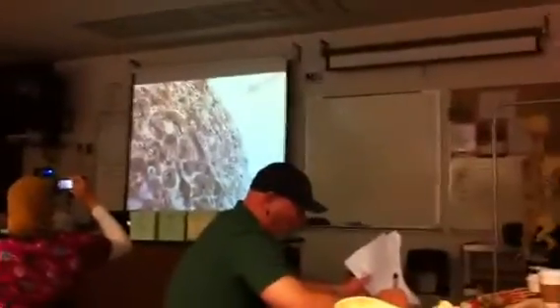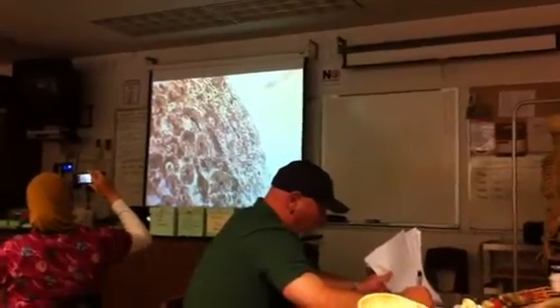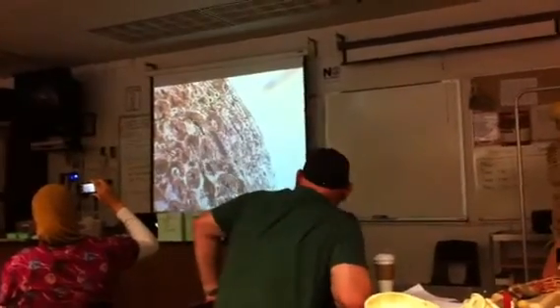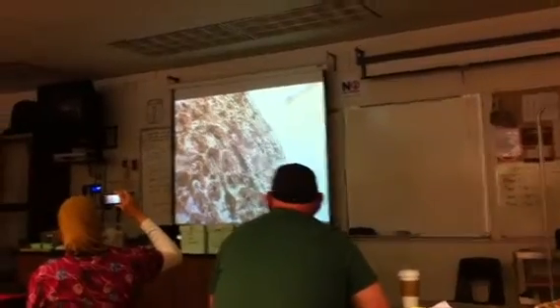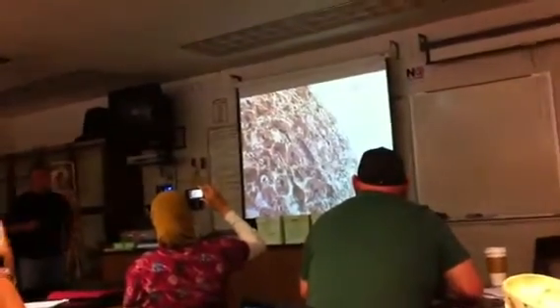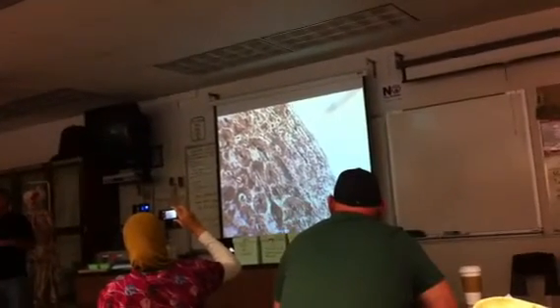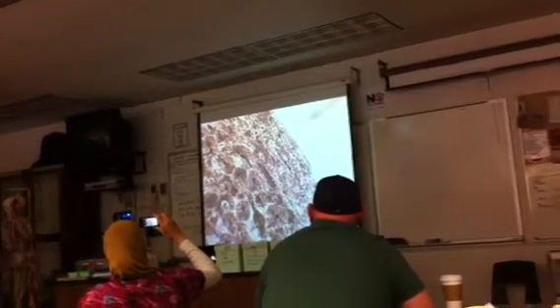So now, I know you know these terms, I hope now. The little round structures, just trying to outline them there for you, are the osteons, and the little dark thing that's kind of filled up with a black dot there, that's the central canal. And that's where the nerves and the blood supply and all that are located. So this kind of just gives you a general overview of what it looks like.